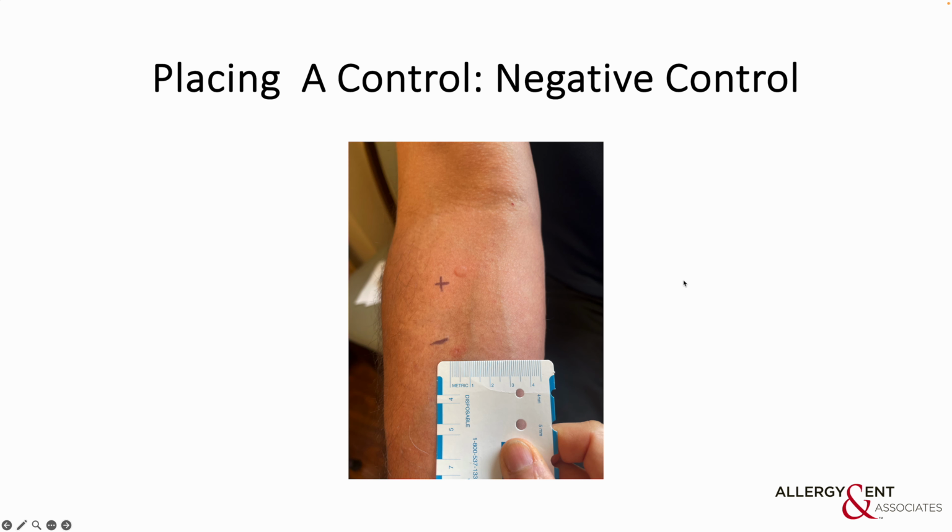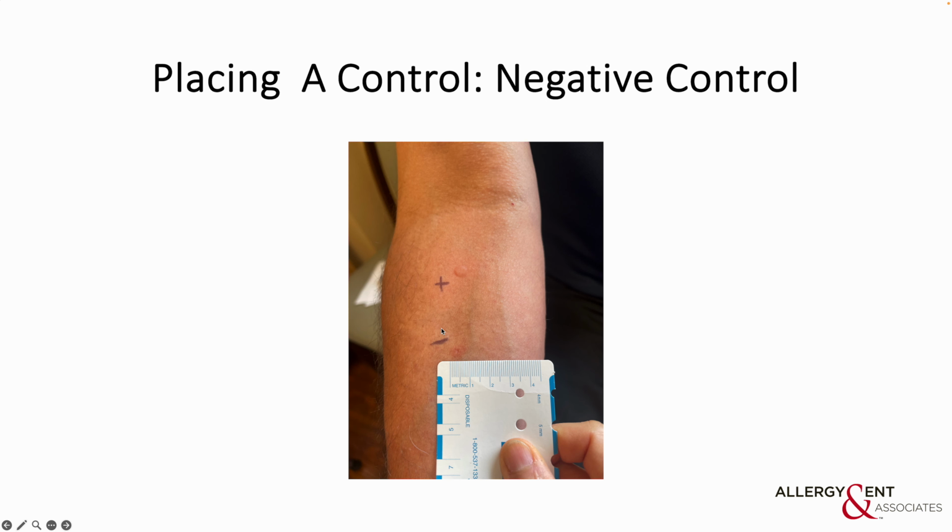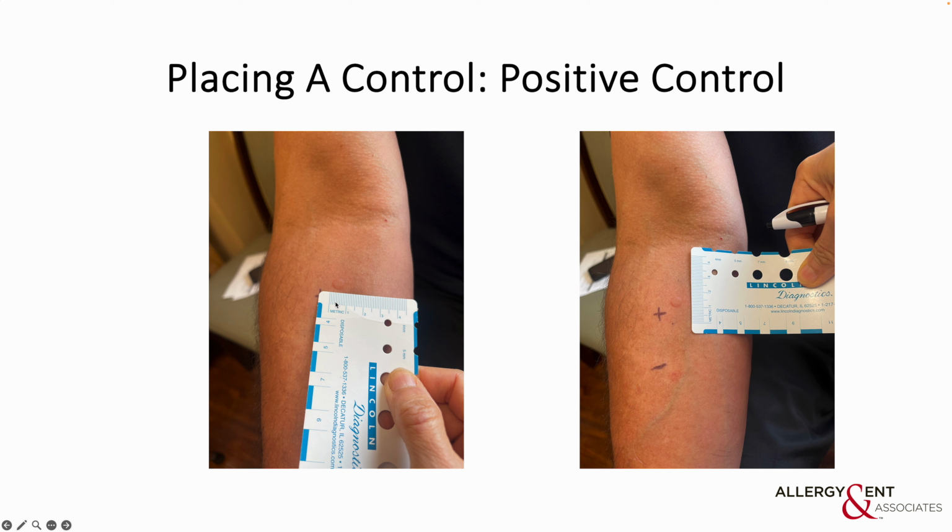Okay, let's talk about the ruler. The ruler here is in millimeter and in centimeter. From here to there, that's 1 centimeter, 2 centimeter, and each small line is 1 millimeter.